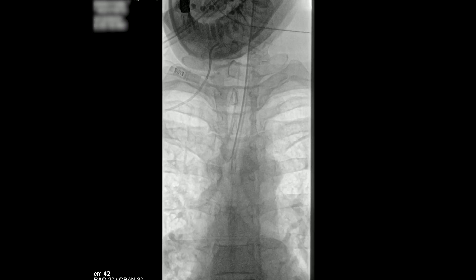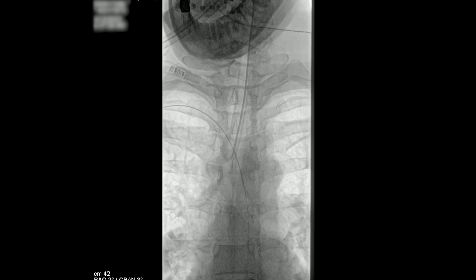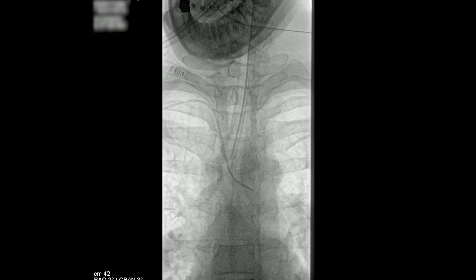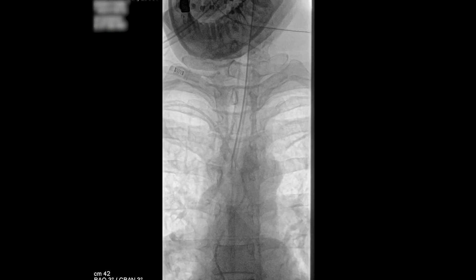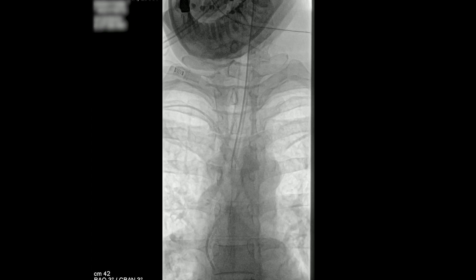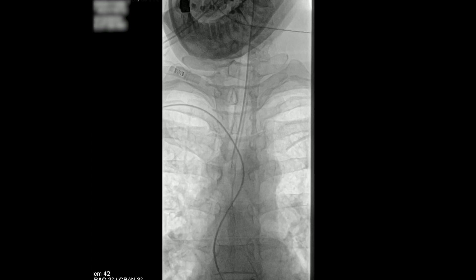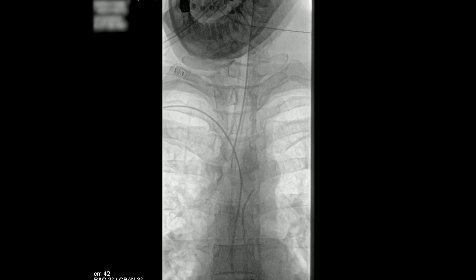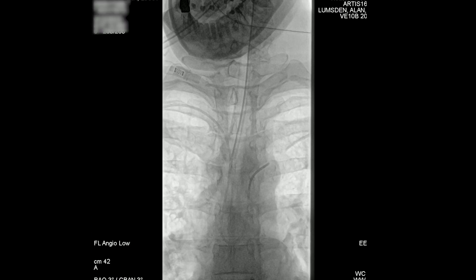Now it's time to reposition the catheter. You pull the catheter back and advance the wire — in this case it looked like it went down the ascending aorta, which is where it usually ends up for the innominate. You're going to deflect the wire back off the aortic valve typically. Then we're going to use the SIM2 catheter — the wire has been deflected back off the valve and the SIM2 catheter has been introduced. Just as if you're coming from the groin, you're going to rotate and pull back to try and engage the supra-aortic trunks — in this case the left common carotid and the left subclavian artery are really what we're looking for.